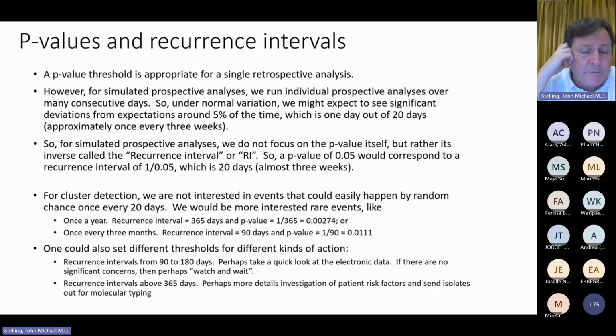If it's the neonatal intensive care unit, I will be more interested. If it's a recurrence interval of 100 with CRE, I'll be very interested. So there's not, again, a precise threshold. It's a question of what action do you want to take. And you could set different thresholds for different actions.